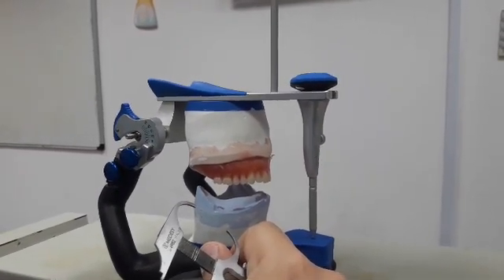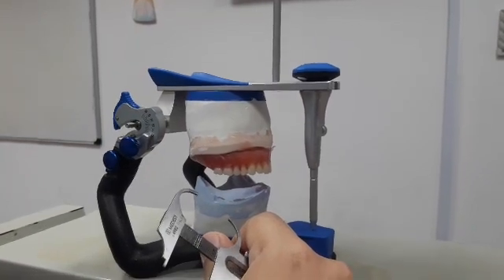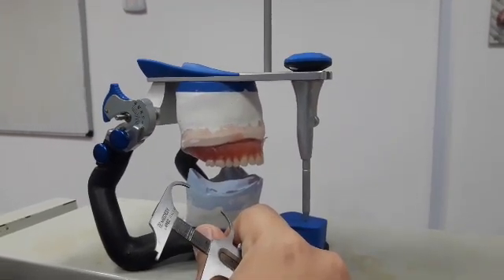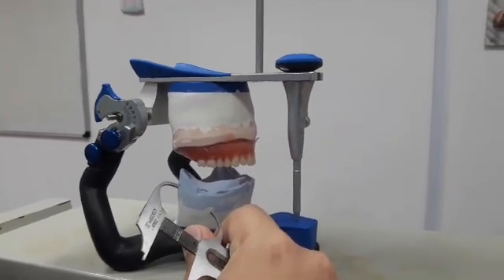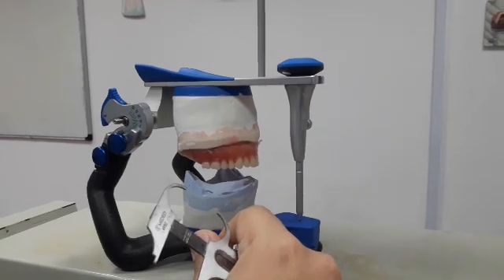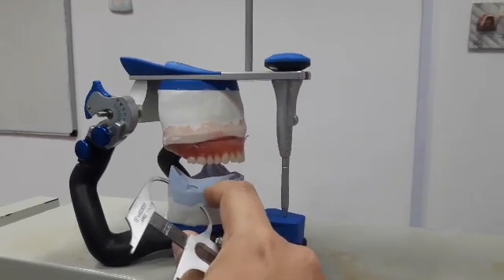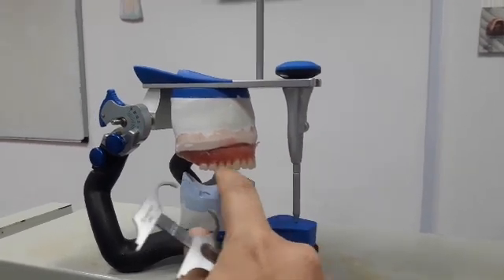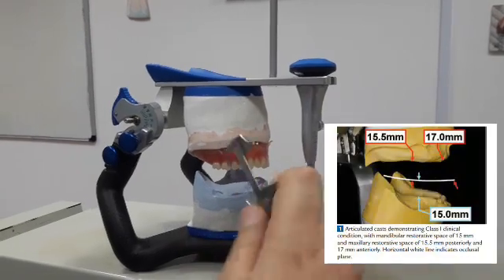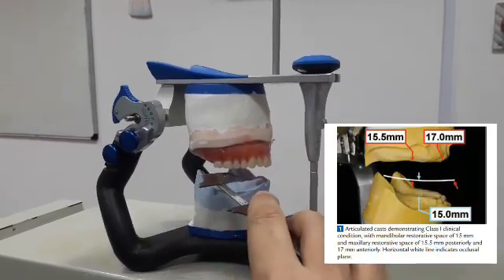For implant overdenture patients, this space must accommodate a denture base of sufficient dimensions and appropriately positioned denture teeth. In order to determine this space, we have to measure from the occlusal plane of the upper to the supporting tissues of the lower.